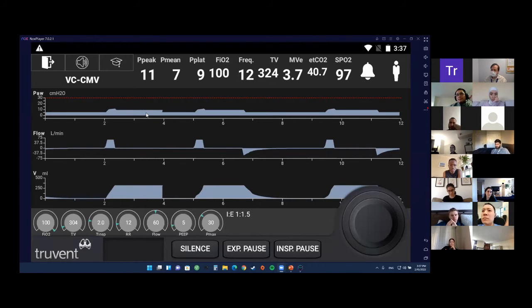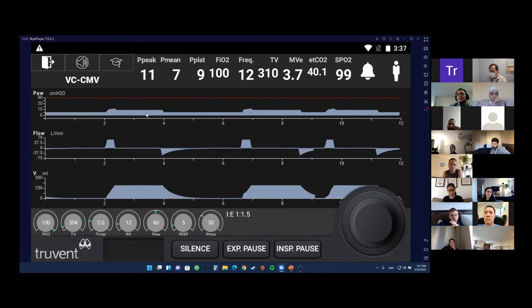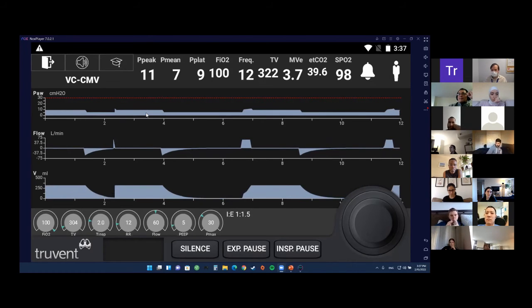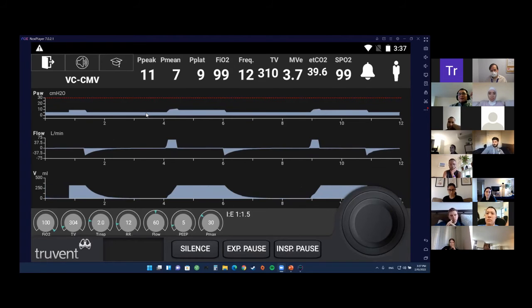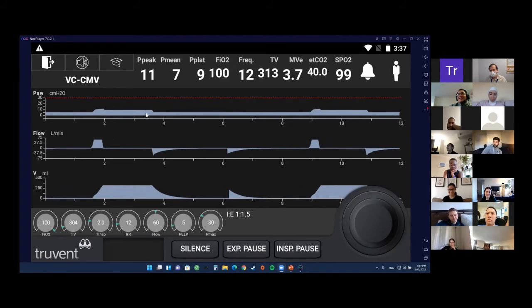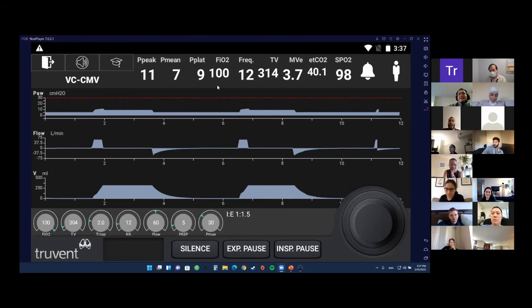Okay, so I can increase the respiratory rate, which is 12, but he's also on a low tidal volume based on his weight. We have to calculate the ideal body weight because the lungs don't scale with actual weight. You can ask one of your co-residents who is in the ICU with you to calculate the ideal body weight while you do the other changes. So who's in the ICU right now? I can help. In the meantime, I would just increase the respiratory rate. Joe already answered in the chat the ideal body weight. How much is it? 75.